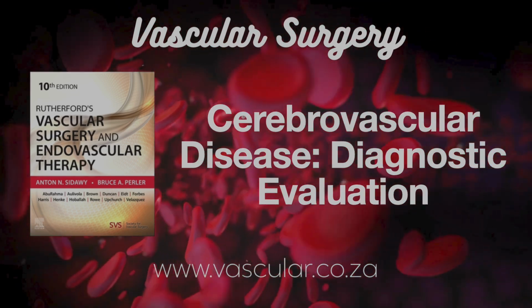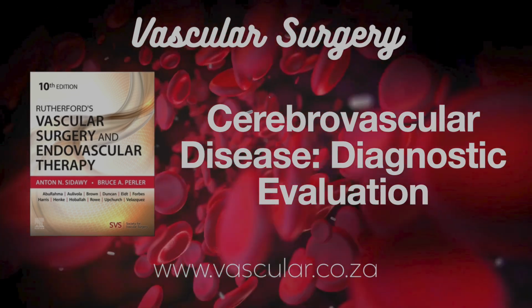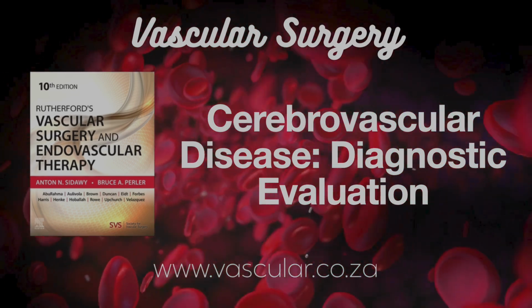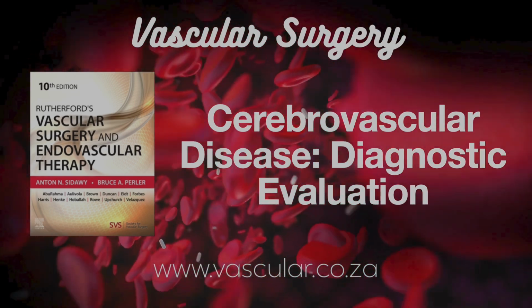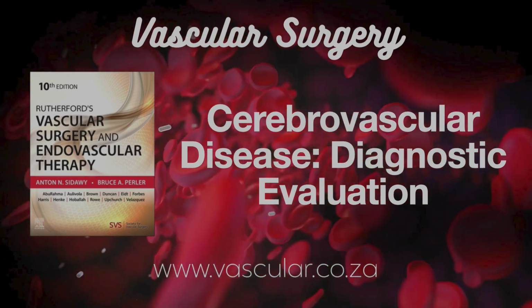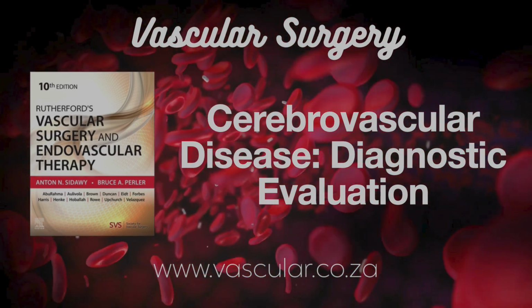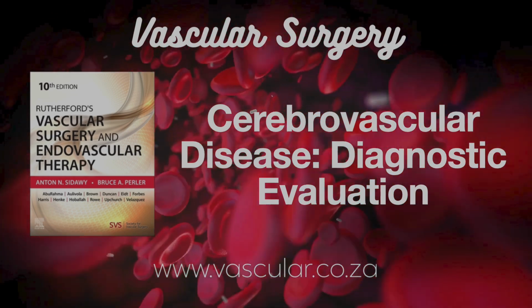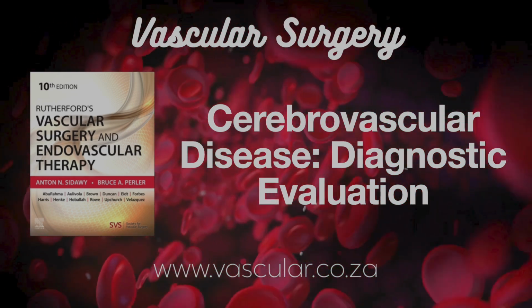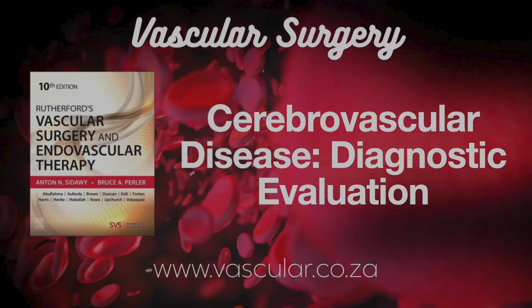Okay, let's break that down. For traditional transfemoral stenting, CAS, what does the CTA need to show? You need to know if the aortic arch anatomy is a simple curve or complex. Are the origins of the great vessels clean or diseased? How twisty is the common carotid? Is there a safe spot, a landing zone, further up in the internal carotid to place a protective filter device during the procedure? What does the circle of Willis look like in the brain in case flow gets compromised? CTA gives you all that. A complete roadmap from arch to brain.